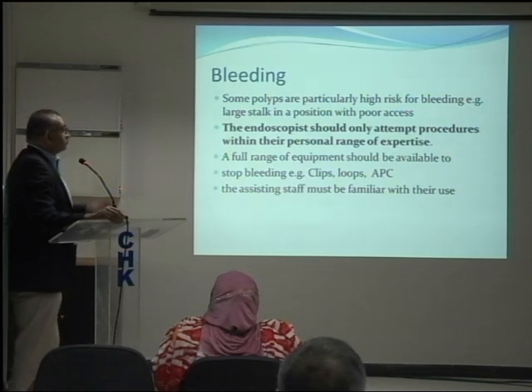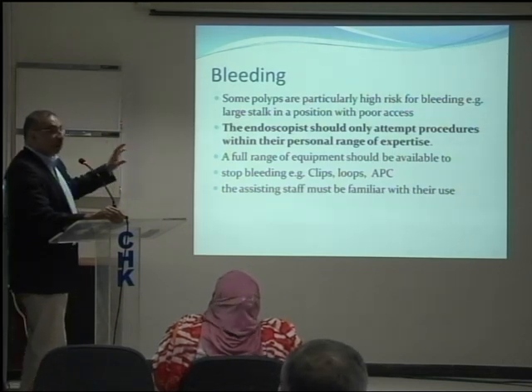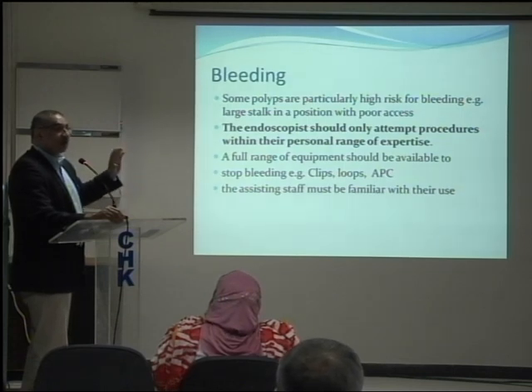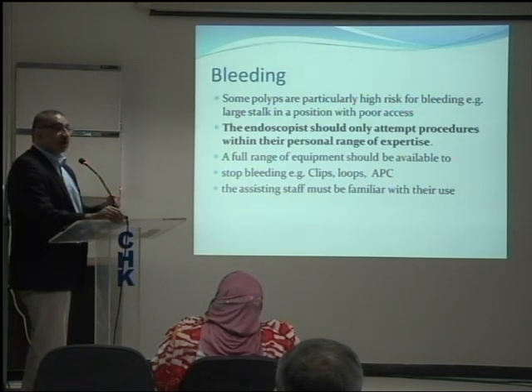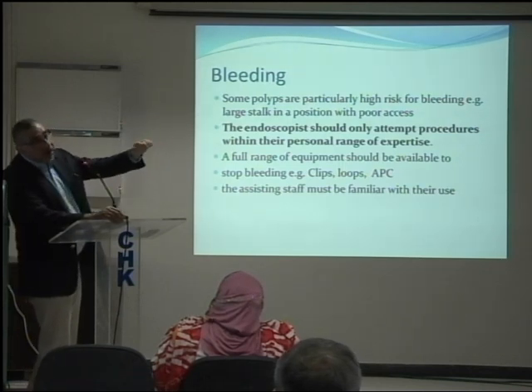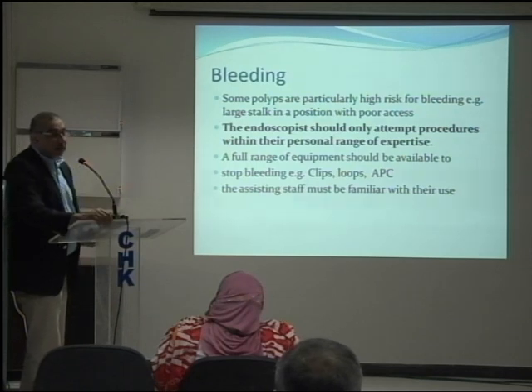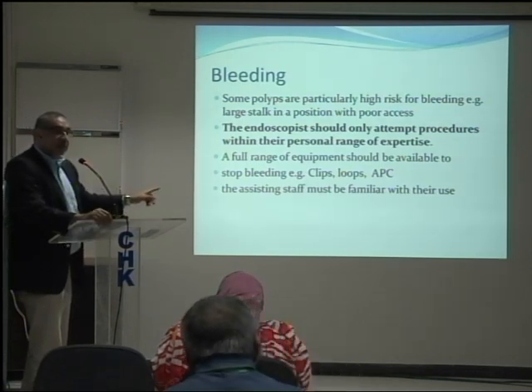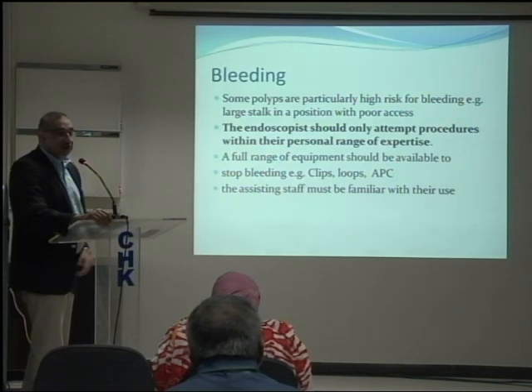Right. Important thing. If you are trying to take a polyp out, make sure you've got comfortable access to that polyp. Not that it is right in the corner and you are trying to get it from an edge and then you try to excise it. Because you might be able to excise it, but if that polyp starts bleeding, then you are in big trouble. Because if you can't get to it, how are you going to stop the bleeding?